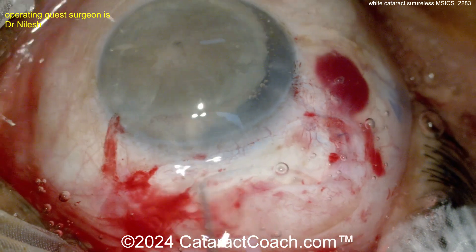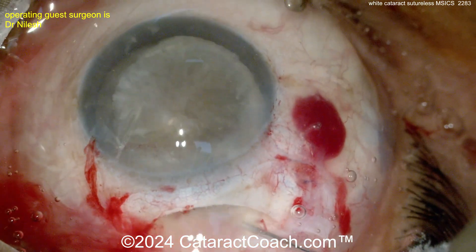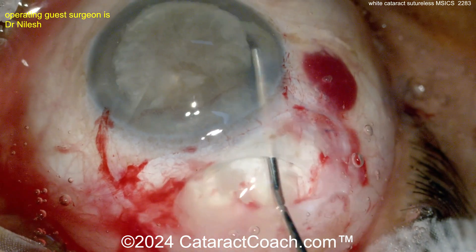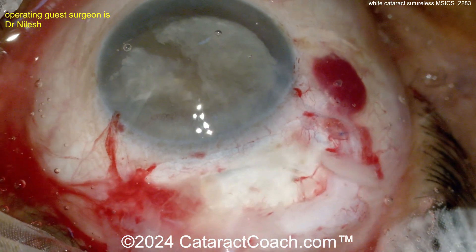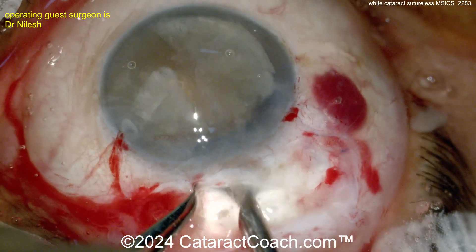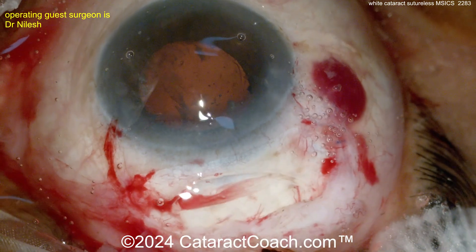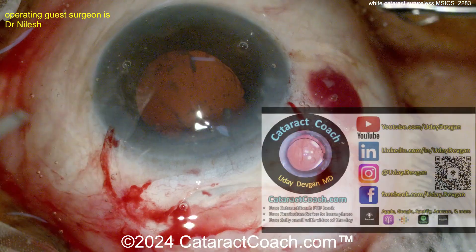Getting the whole nucleus up into the anterior chamber — that looks great. Now time to deliver it. You can see releasing some fluid, and now viscoelastic is going behind it to protect the cornea and protect the capsular bag. Here's a lens loop — remember, don't push up, don't touch the cornea. That's an irrigating lens vectus, and so we irrigate some of the lens material out.